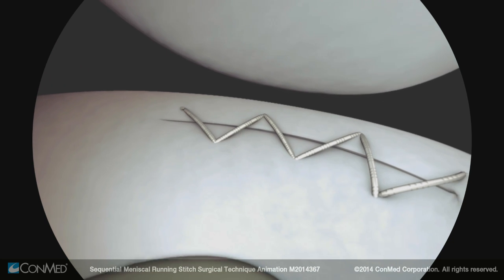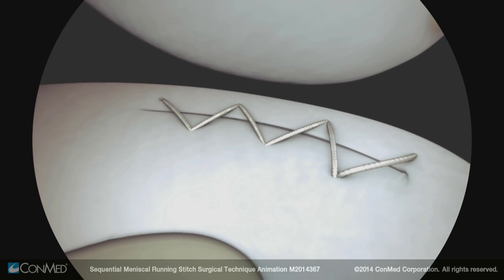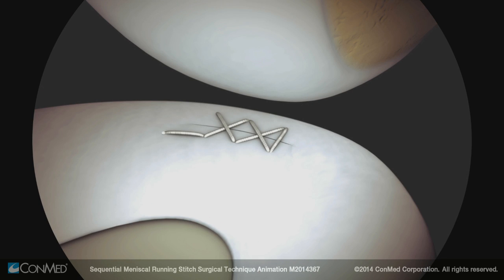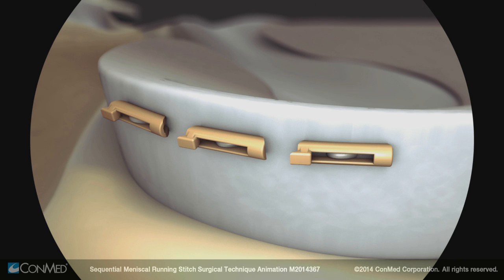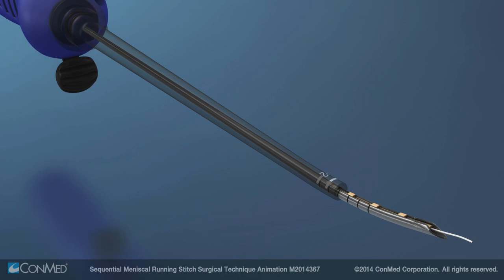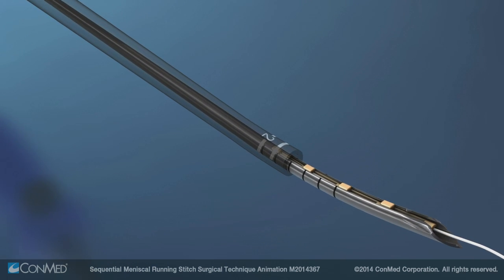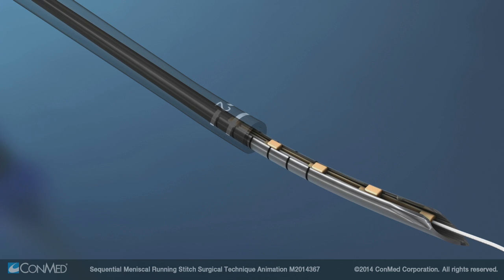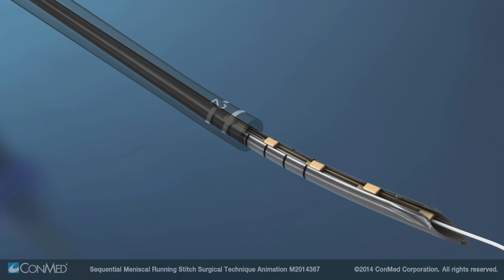The most important benefit of the sequent is its multiple sequential stitch capability, providing the versatility to fix numerous types of repairs. The sequent allows the user to change portals or create a new sequence of stitches during the surgery and still use the same device. When using this technique, the user should ensure that there are enough implants remaining in the device to create the desired number of stitches.